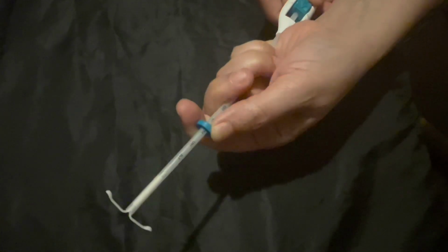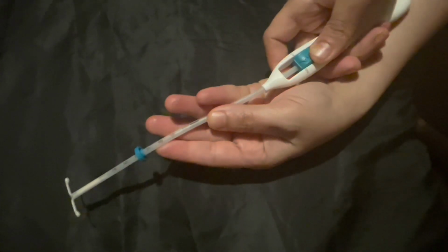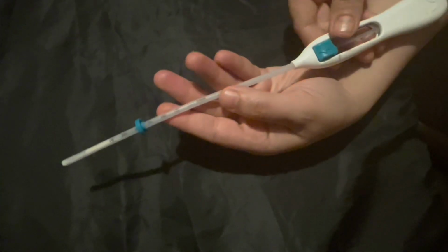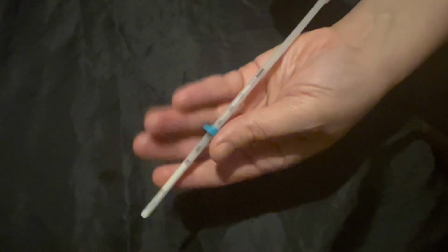So again, when you measure the sound of the uterus, you adjust this flange to the measurement and then move the slider forward like that. This brings the arms inside the tube. Then insert it through the cervical canal as usual, and once you reach the fundus, we need to release the arms.